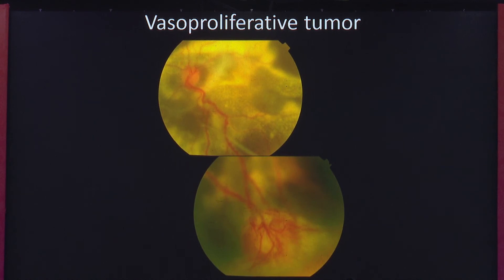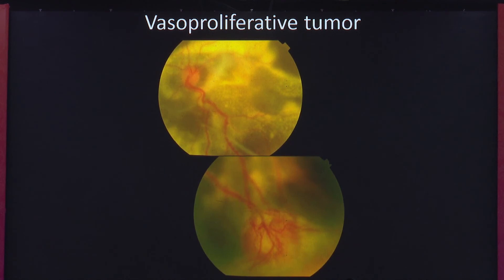Another lesion that causes extensive subretinal exudates is the vasoproliferative tumour. This is a classic vasoproliferative tumour — you can see the vessels and a yellow-orange tumour fraction in the inferior periphery. It is usually located inferiorly and associated with exudative retinal detachment and exudates.